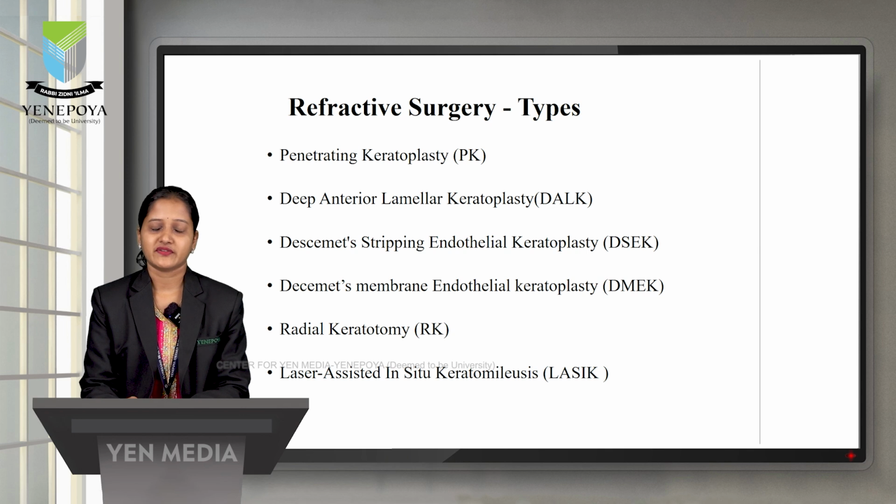So what are the types of refractive surgeries? We have penetrating keratoplasty, abbreviated as PK, deep anterior lamellar keratoplasty, Descemet's stripping endothelial keratoplasty, Descemet's membrane endothelial keratoplasty, radial keratotomy and laser assisted in situ keratomileusis.